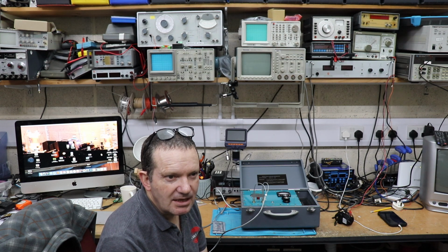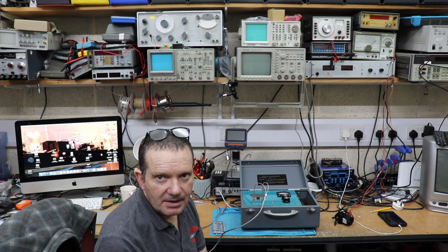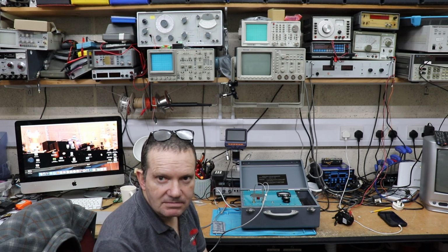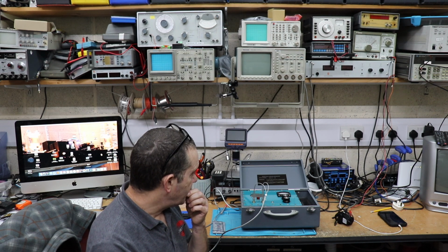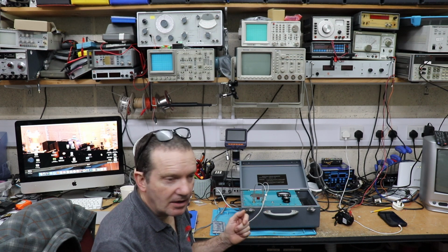They're nice little machines, they do the job. But I would say they're probably a bit flimsy. They're plastic things about the size of a calculator or a bit bigger, and they do get knocked about a bit, and they do tend to break. So this one's obviously the one I made, which is a bit sturdier, and hopefully won't be quite so prone to breaking.